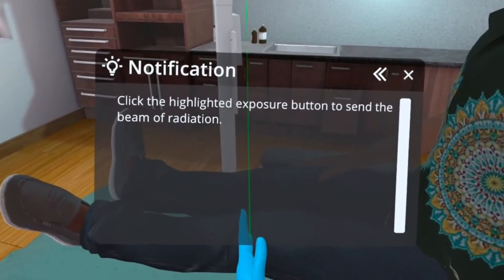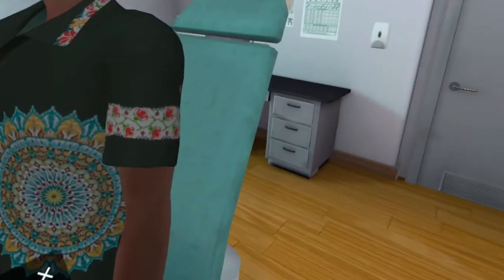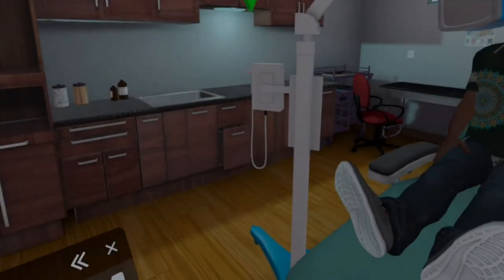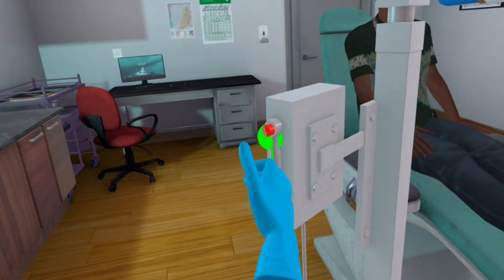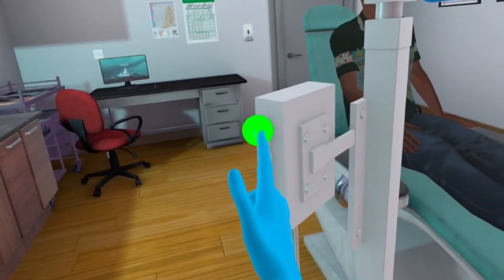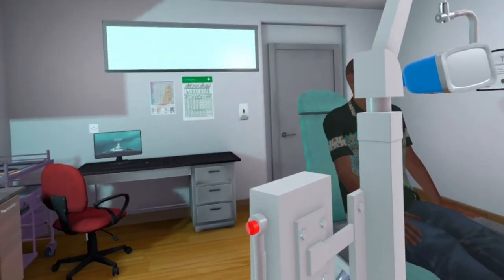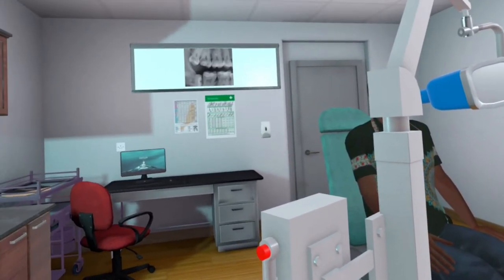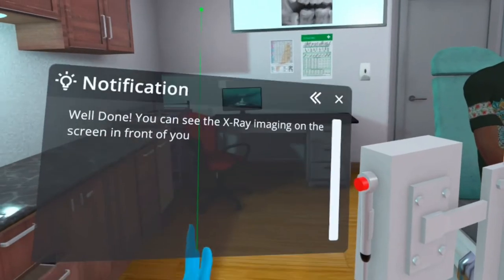Click the highlighted exposure button to send the beam of radiation. Well done. You can see the X-ray imaging on the screen in front of you.